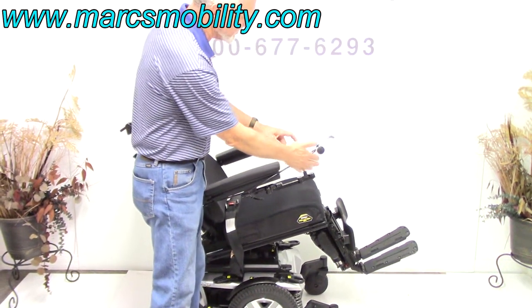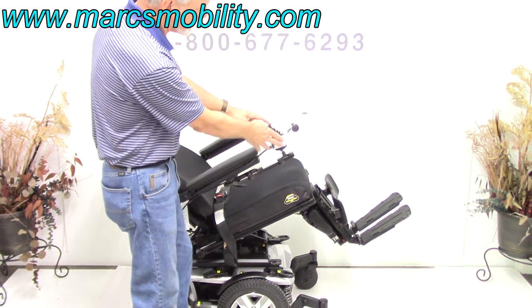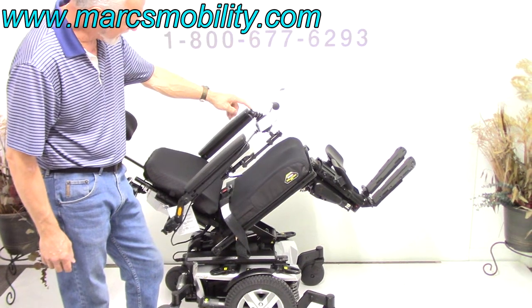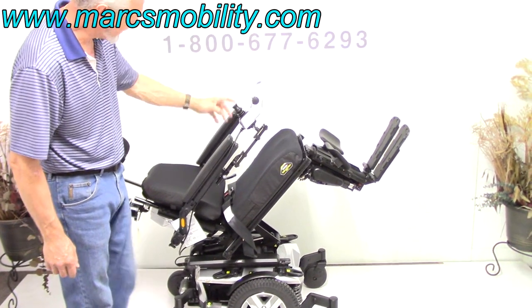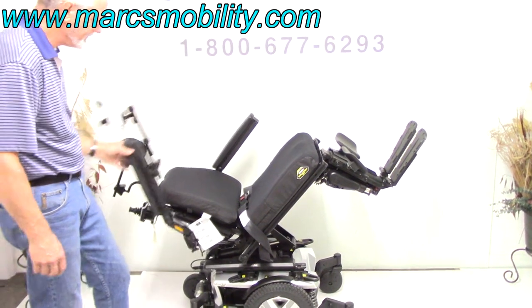This is a swing-away joystick, so it will swing from the front all the way to the side, and we can put this joystick on the left side if you're left-handed with no problem. The arms can be moved out of the way if you need to, on both sides.